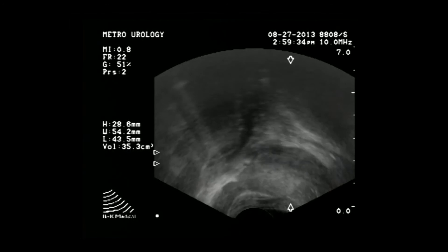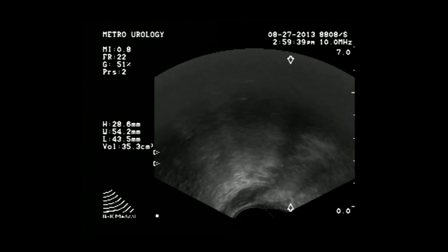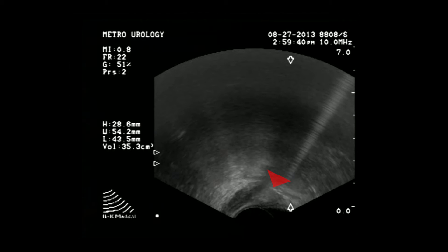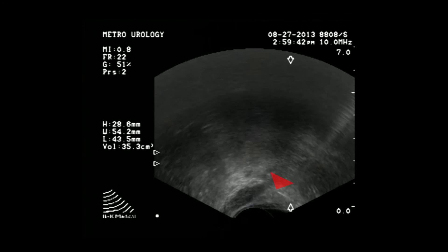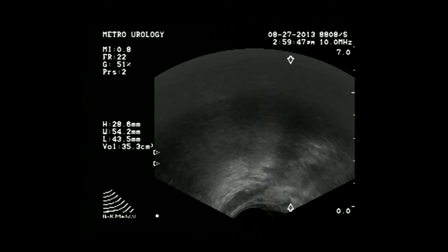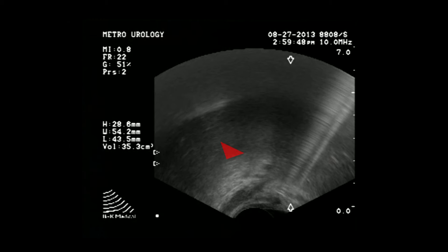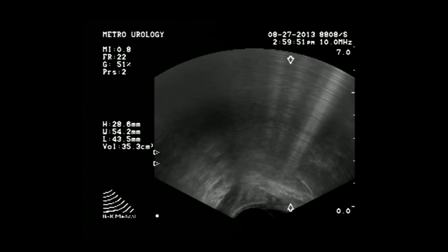Now I am on the right side. Here is the traditional Mount Blanc area. My needle goes in about 2 or 3 cc's, and then I pull back under the prostate and leave another 1 or 2 cc's. Then I go lateral and go above Mount Blanc and put another 2 or 3 cc's in this area. Again, remember this will be a gritty feeling and the patient will experience some discomfort — that indicates you are in the right spot.